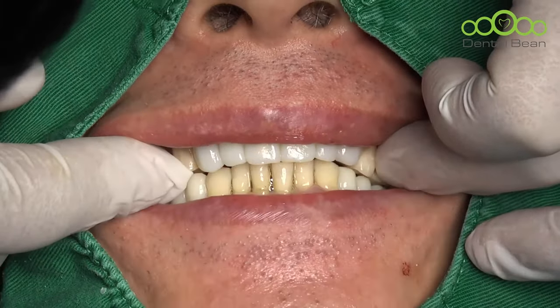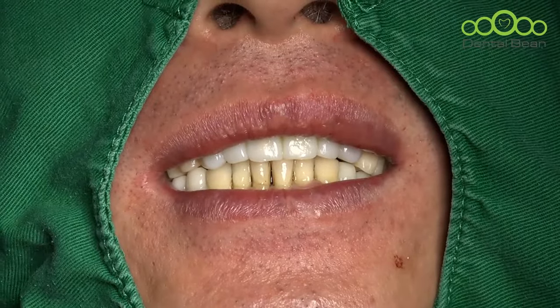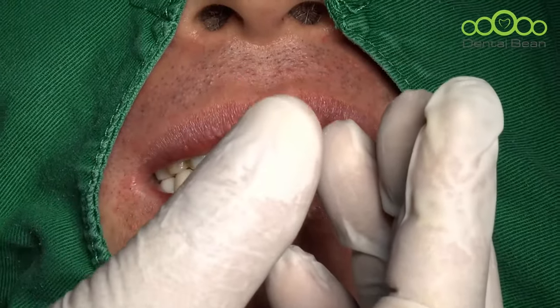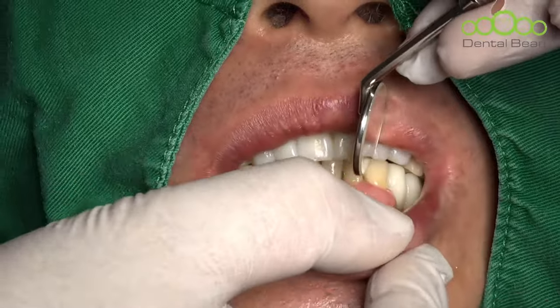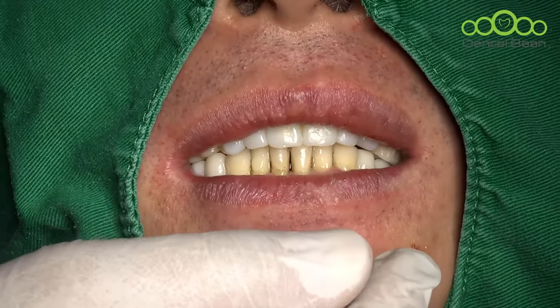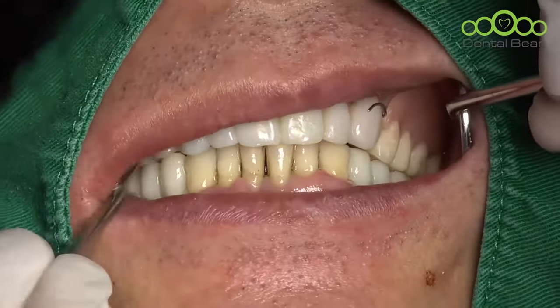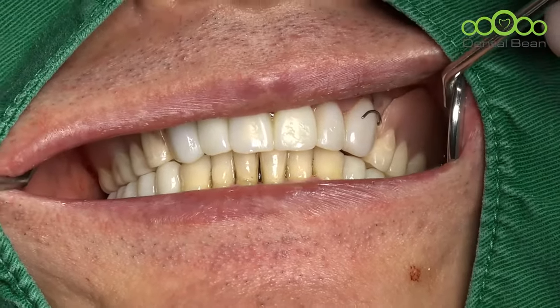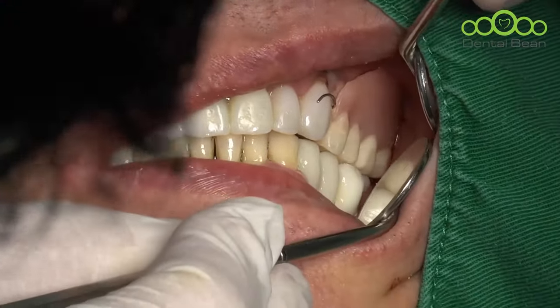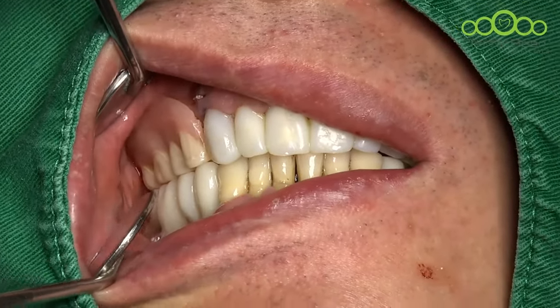And retract. Please give me the retractor. And then it's good to evaluate the occlusal scheme. Okay, the occlusal state is same as it was.